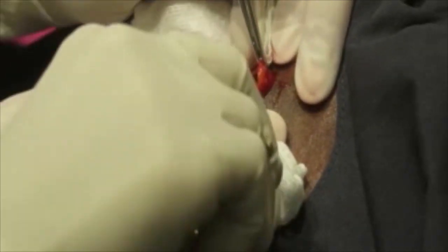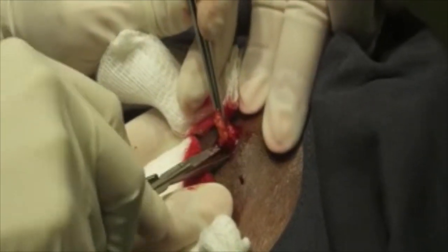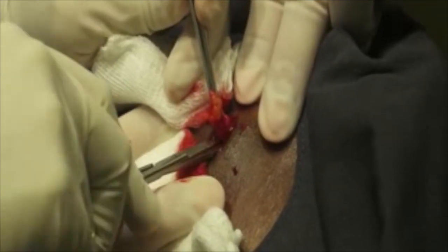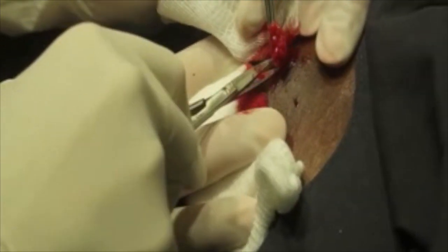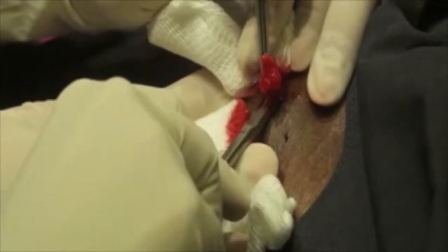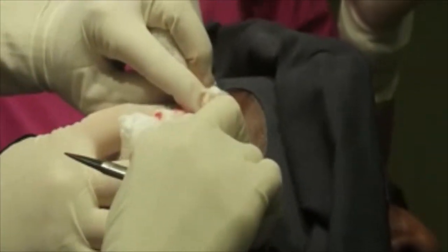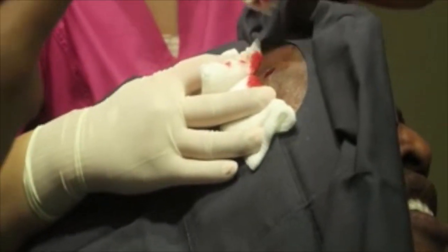Look, it kind of keeps going, huh? This gauze is too close here. Yeah, it keeps going. Oh, I think I see a little face. Just kidding, I know he was concerned about that. I'm trying to keep it in as one piece as I can so that I can show it to you. It's more dramatic that way. I don't think that's everything, but we will see what we have there. I think most of it is up, but there's still a little bit left underneath.